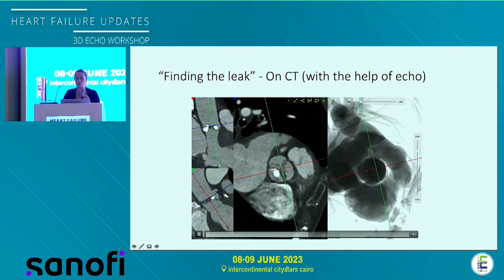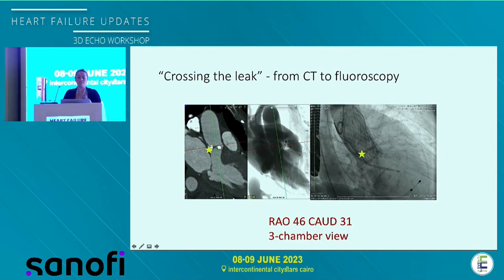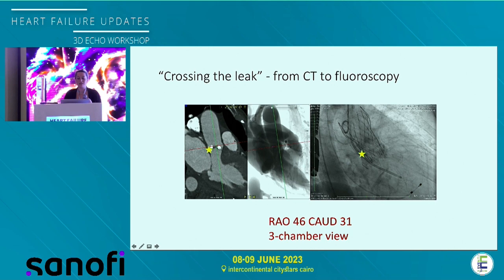We put the hair cross perpendicular, we found the 3-chamber view, and we lateralized the defect, because in the end we will send our wire adjacent to the wall of the ascending aorta.